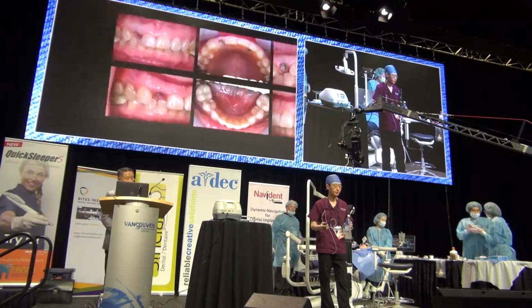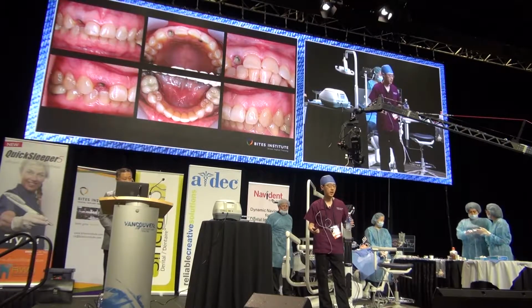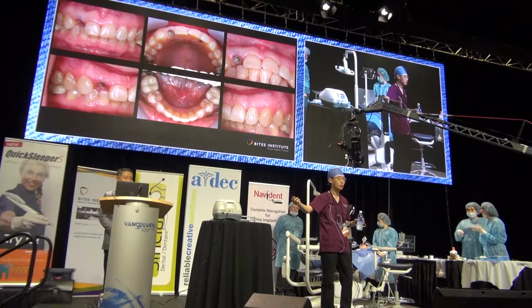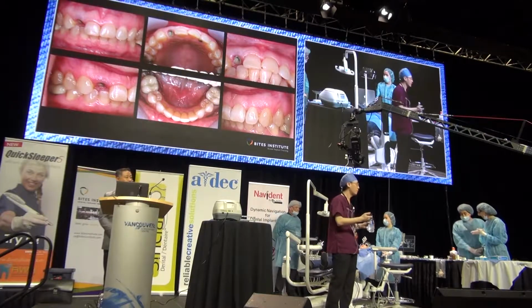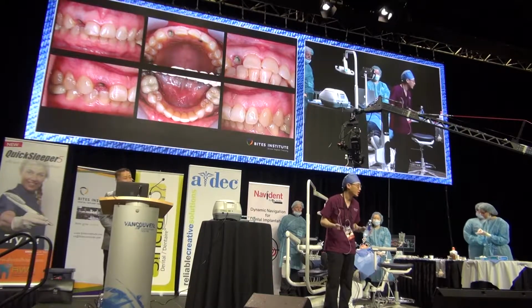Look at over here. We have an intraoral photograph, and as you can see, it is a gum line fracture. So when you have a gum line fracture like that, what's going to be the difficult part? Implant placement or the extraction? Extraction. So I am putting my risk on the stage today. We might have a hard time taking this tooth out. This is as real as it gets.